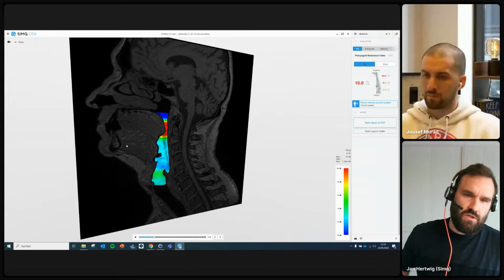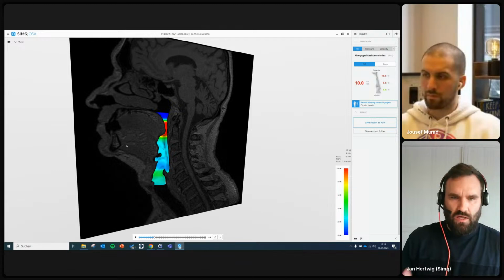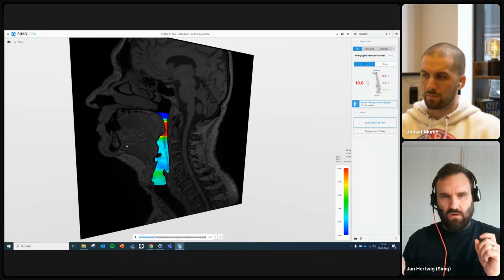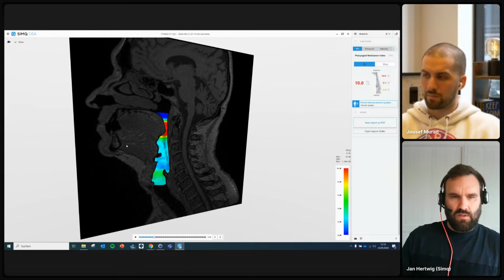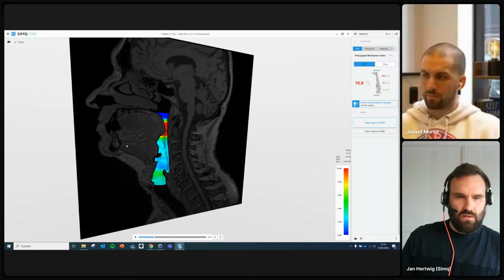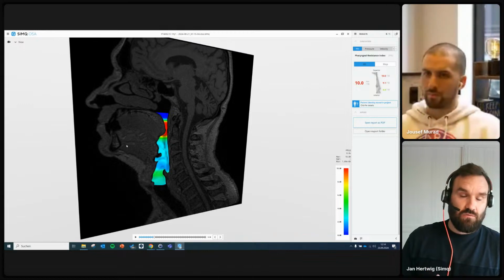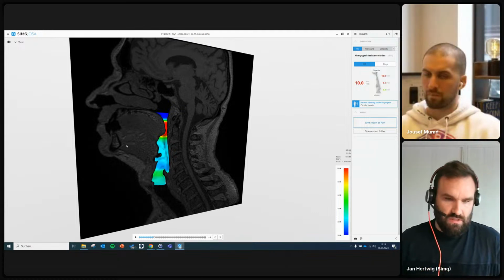So ML technology with picture recognition, and you train a model, a UNet, to always make the same quality 3D models out of it, so that you can really do analysis on it. And the important part is same quality, so that you can make analytic or medical or clinical decisions based on it. So it shouldn't be too sensitive.